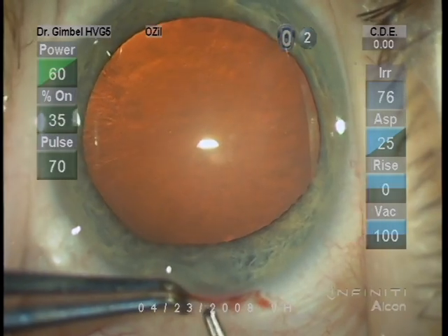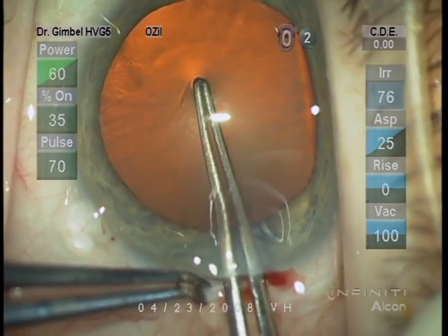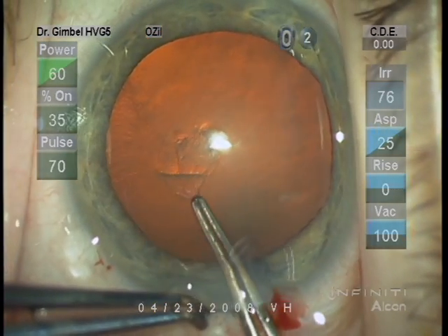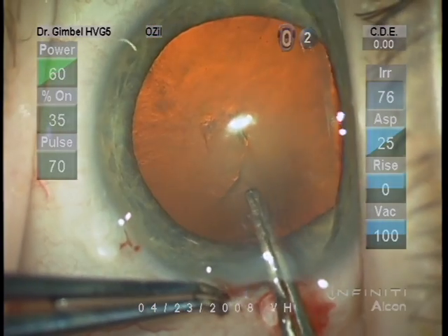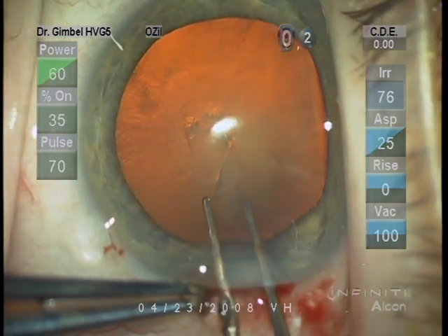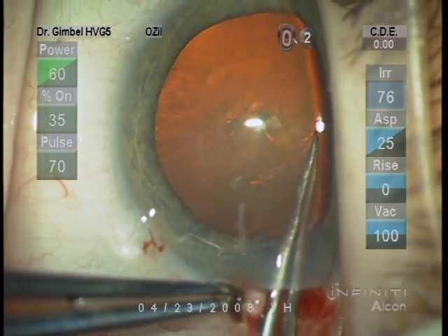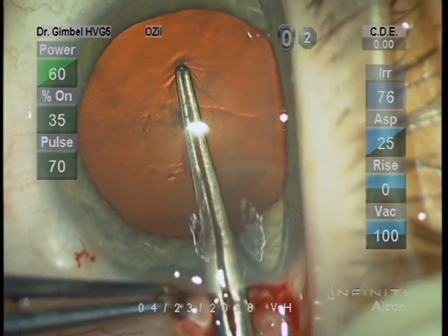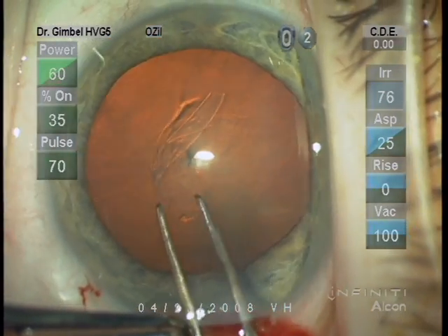I think that the globe should always be fixed with the second hand. It can be done with forceps, as illustrated here, or with a fine Thornton ring. My preference is to puncture the capsule with the capsulorhexis forceps, and then carry it in a counterclockwise direction, but what direction and where to start is entirely surgeon preference.